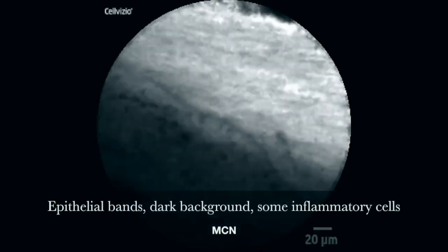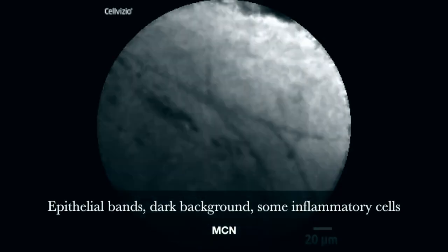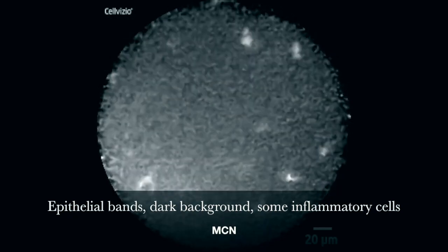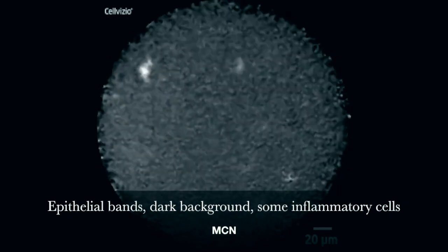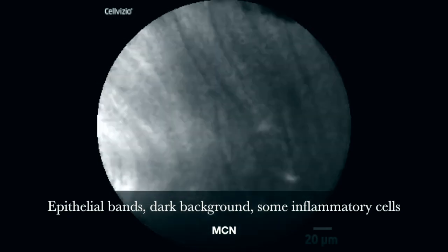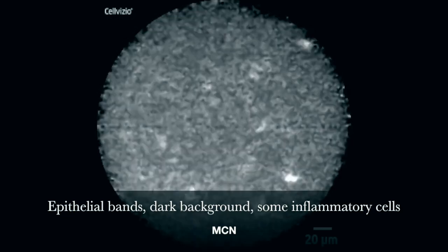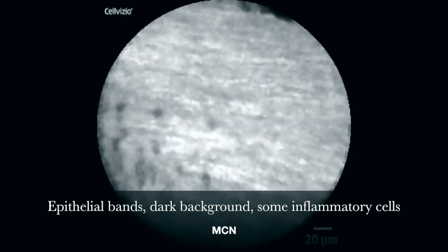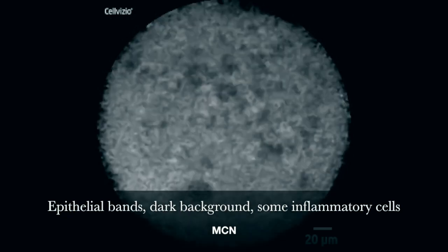Again, to compare, here is the video of MCN. There's a background of some inflammatory cells. Again, here is a dark background with some bright particles, which are again inflammatory cells. Dark background means atrophic epithelium. Now you see very flat epithelium, thin layering of the epithelium, which is diagnostic of mucinous cystic neoplasm.